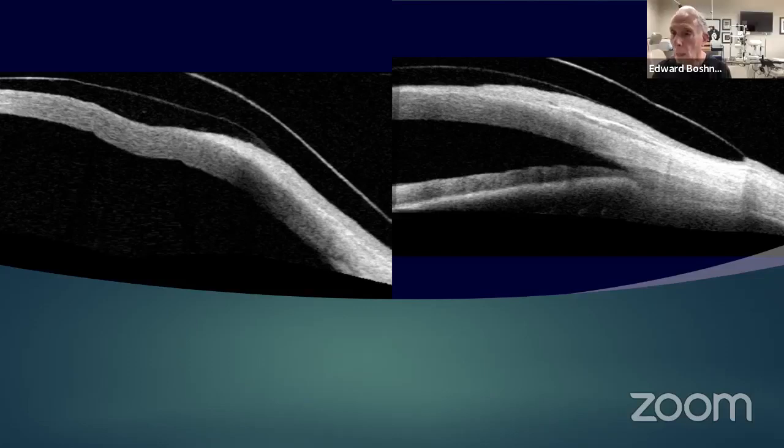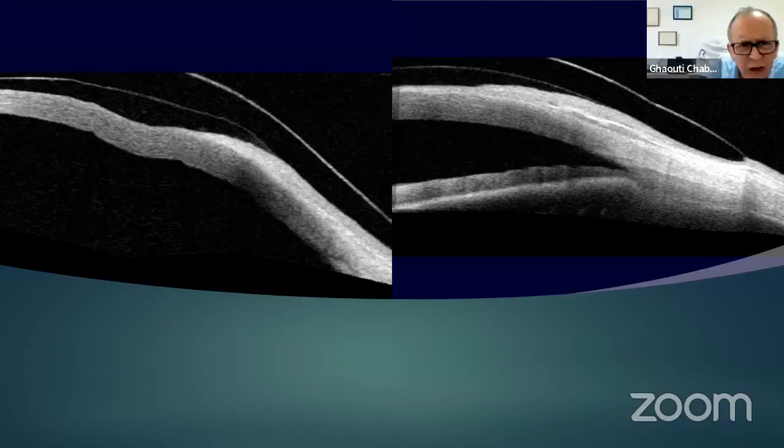Yes. And I think going forward in the future, this aberrometry technology is going to blossom. You're going to see more laboratories utilizing that information to embed it into the optics of a scleral lens. I don't understand it very well. I know it works and it's available here. And if it's available here, it's going to spread to other places in the world. I think aberrometry is becoming a very nice and useful tool.